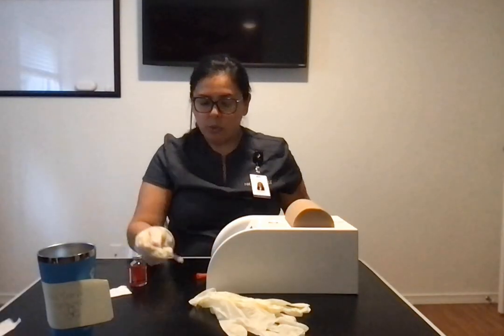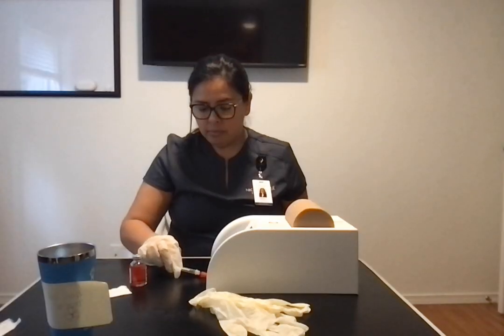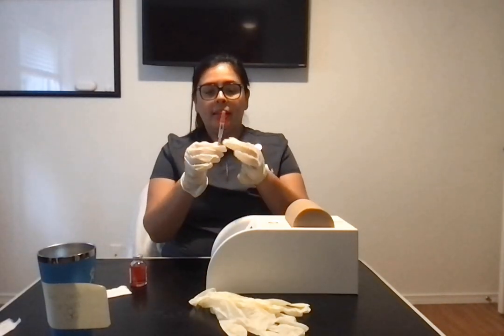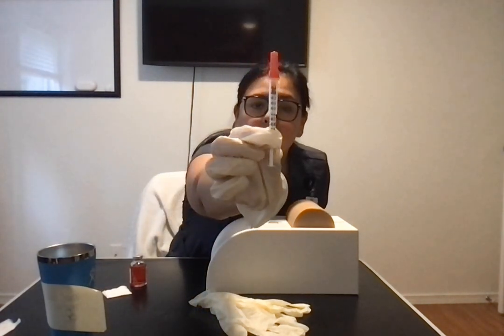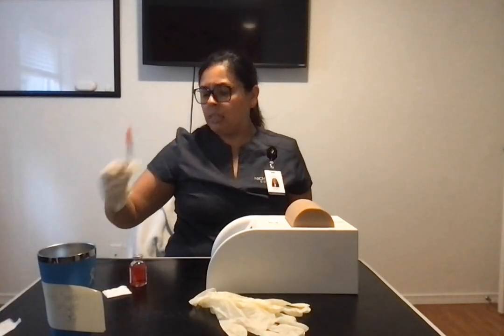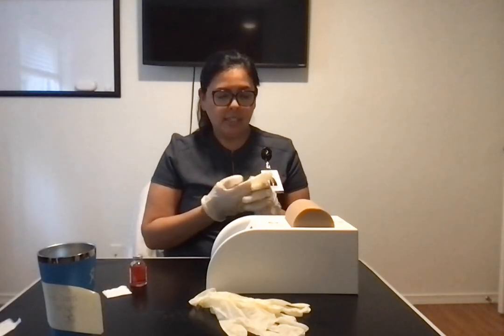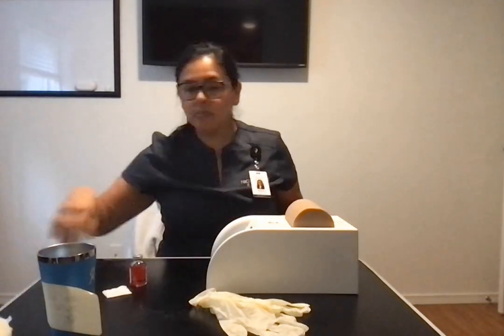Next, I'm going to scoop this back on so that it's ready to go. And that's my 0.1 mLs. Hopefully you can see that medication. All right. So next I'm going to throw this away into the trash. And now I'm going to inspect the patient's arm.